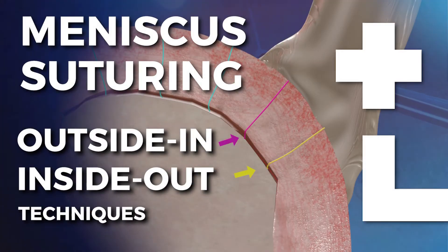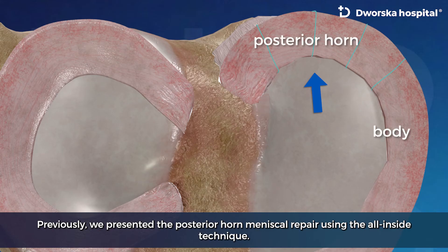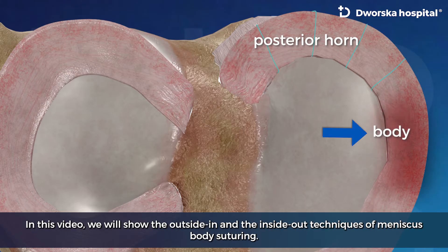Meniscus suturing: outside-in and inside-out techniques according to preferences of Grzegorz Jarosławski, Dworska Hospital. Previously, we presented the posterior horn meniscal repair using the all-inside technique. In this video, we will show the outside-in and the inside-out techniques of meniscus body suturing.